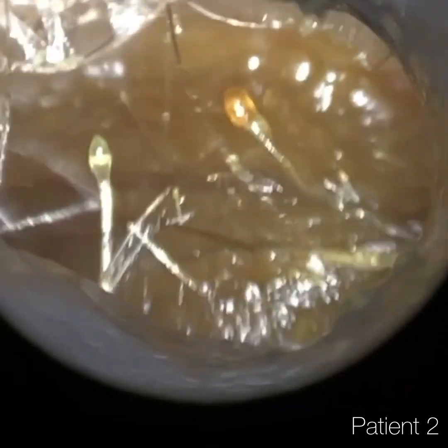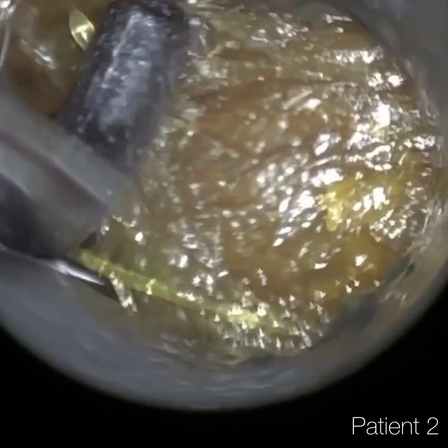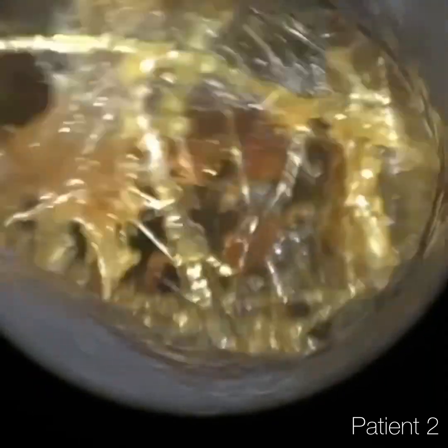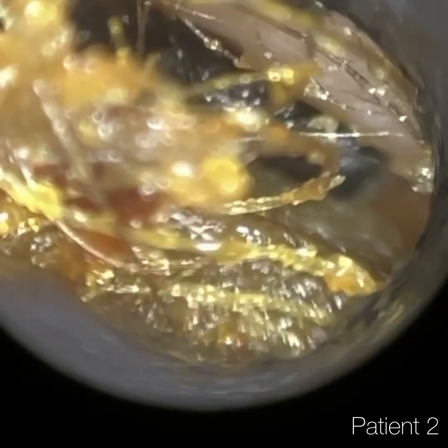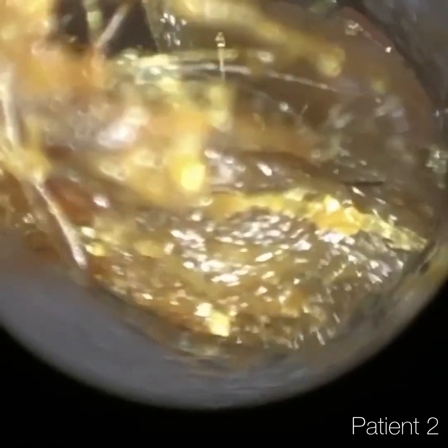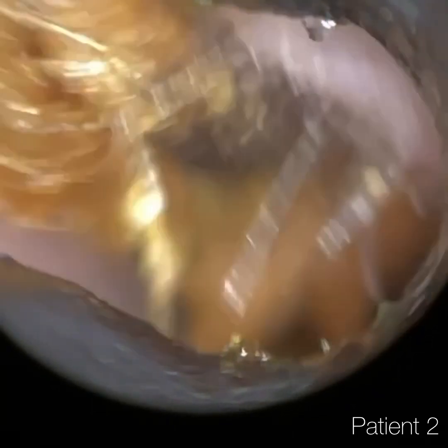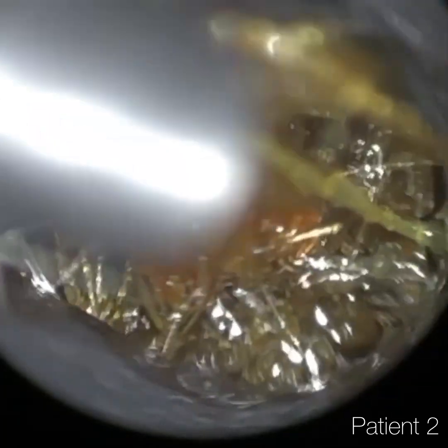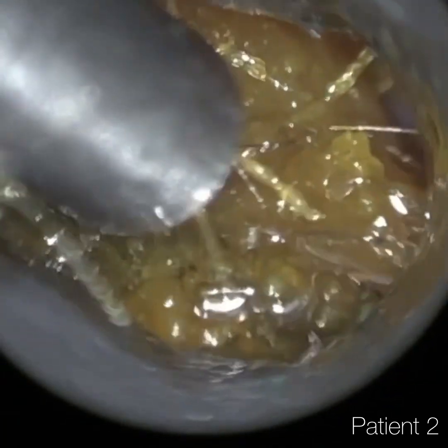You can just see how easy it is to insert the ear hook. I'm just gliding it at the top, now going to the front part of the ear canal, just trying to detach it and pull the skin inwards away. I managed to remove some matted earwax there. I've put some olive oil spray in just to help bind the wax together and lubricate the canal wall and also the inside of the suction probe.